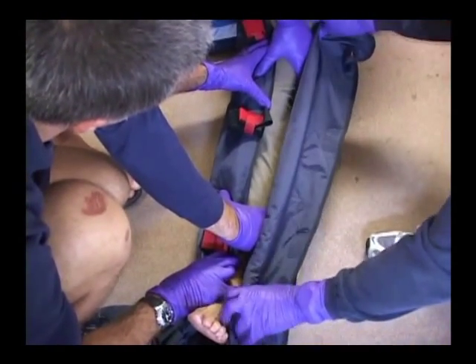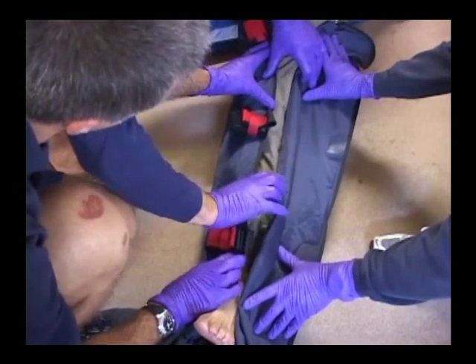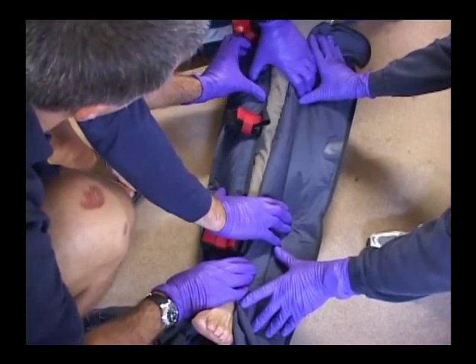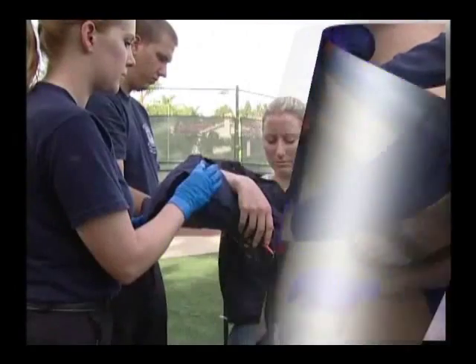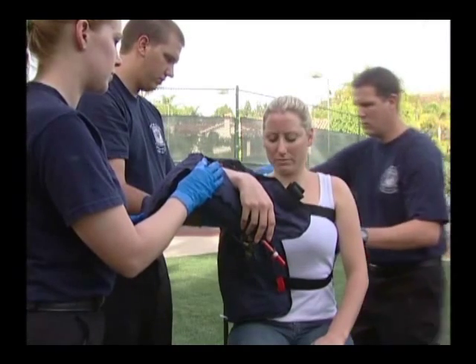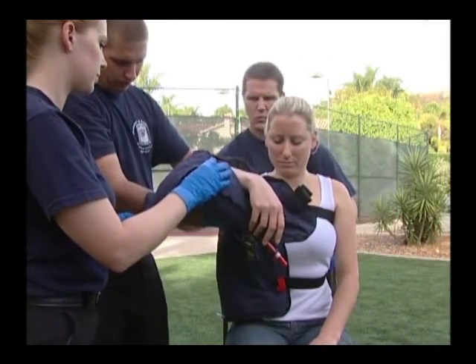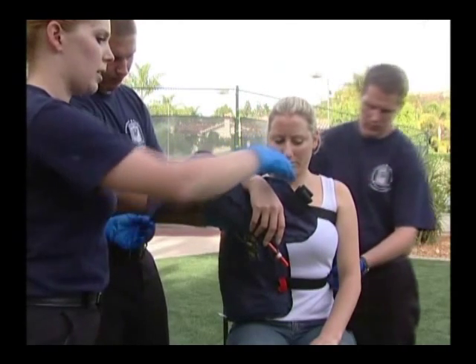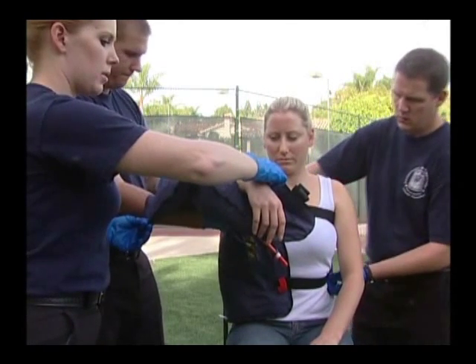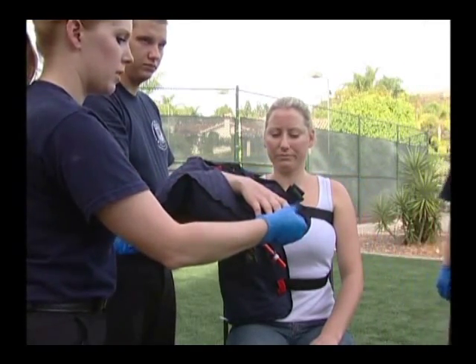Hold the splint in place hands-on stable by grasping both top leading edges above and below the fracture site. Once the splint is properly applied, release your support of the extremity, letting the splint cradle the suspected fracture site, still assisted by your partner's hands-on stable support, which maintains the injured limb in a desired and comfortable position.